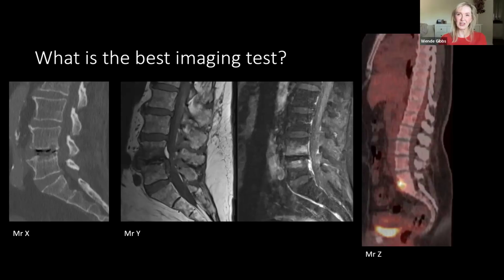The mystery is why does it look like fluid on MRI then? I don't know the answer. I might need to do further investigation and see if there's a new answer to this question, because I think not many people know why it has different appearances or exactly what it is. But you do see air in discs, even when there are disc extrusions and protrusions, you can see air in them sometimes. So it is just sucking in that nitrogen or air from the tear, from the annular tear fissure, I guess.